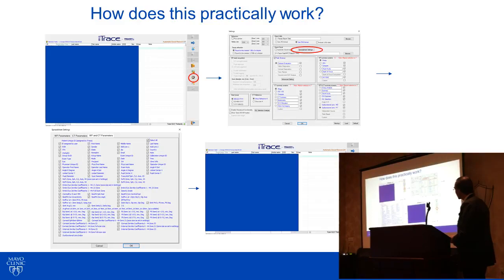And you can basically get 3 different spreadsheets back. You can make a spreadsheet of all your corneal topography measurements. You can get a spreadsheet of all the wavefront measurements. And then you can get a combined spreadsheet for all the wavefront and corneal topography measurements that the machine associates with each other. And by associating these, you get the derived information, so the internal optics, and you also get the dysfunctional lens index.